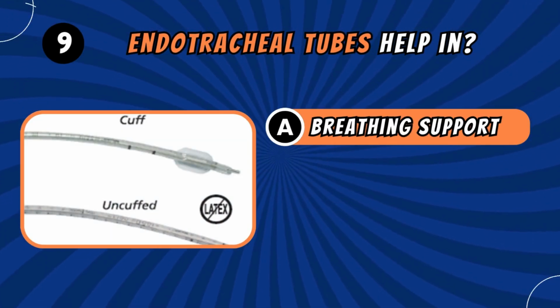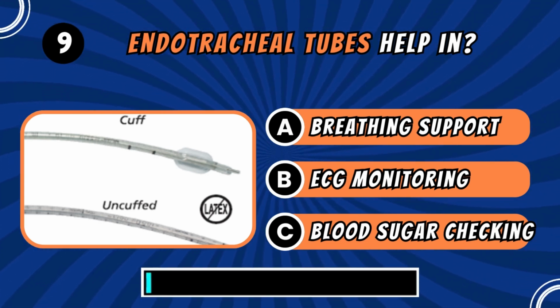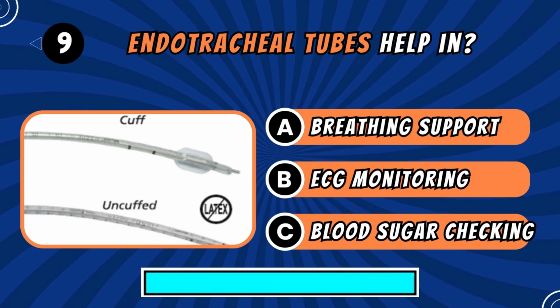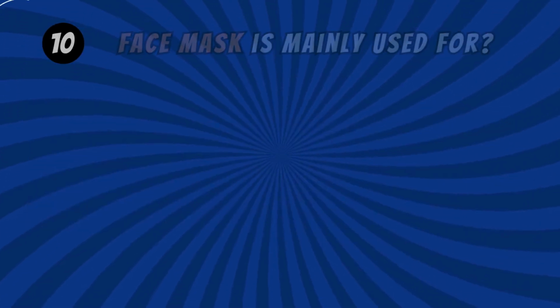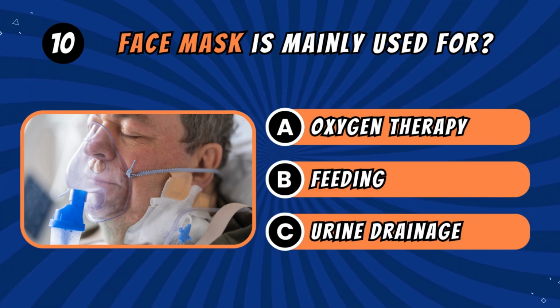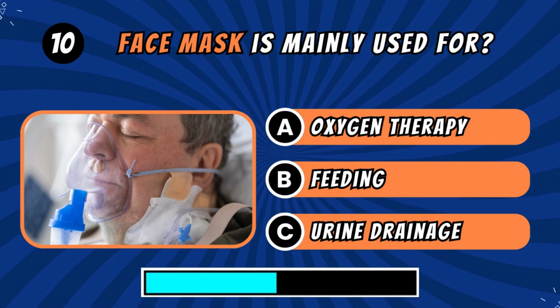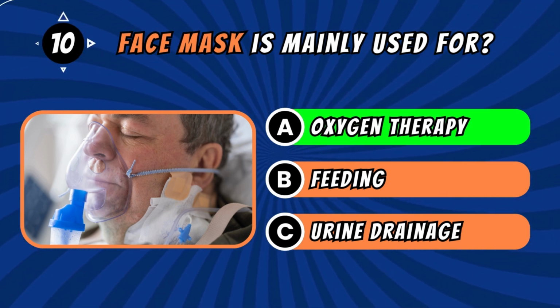Endotracheal tubes help in? Answer A. Breathing support. Face mask is mainly used for? Answer A. Oxygen therapy.